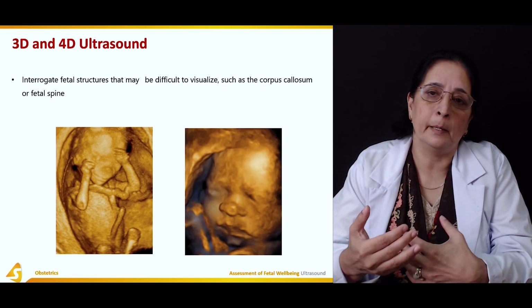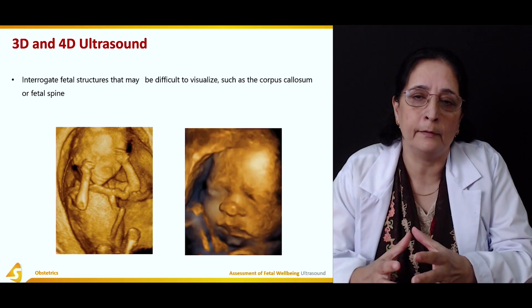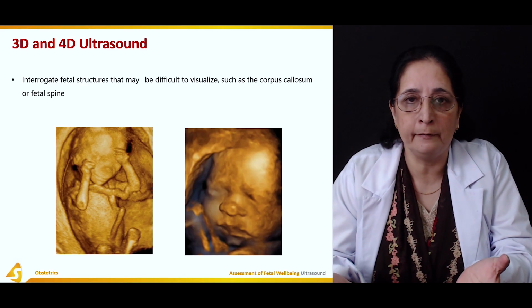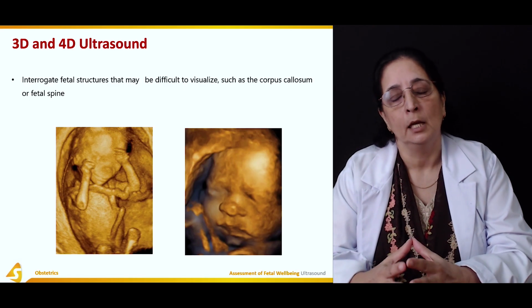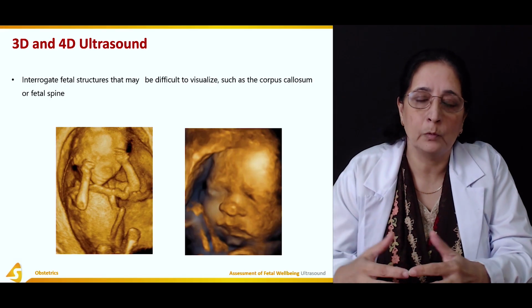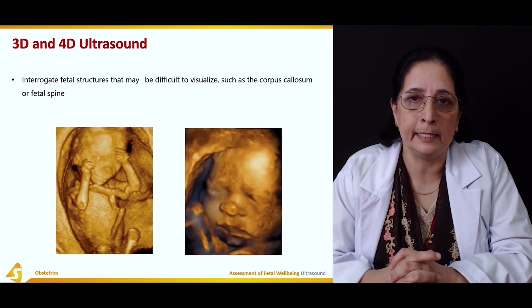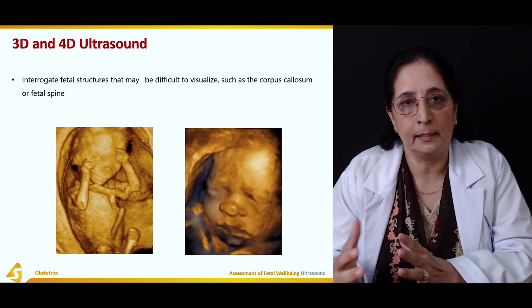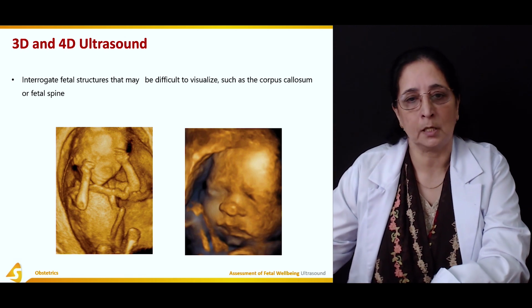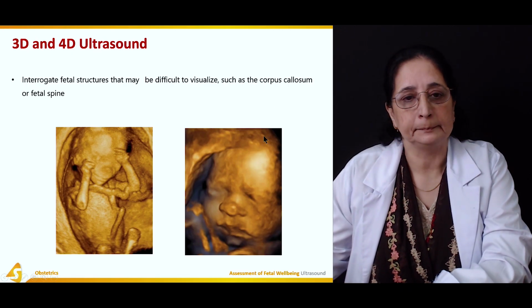So in females who have high-risk pregnancies, or a history of previous pregnancy loss, 3D or 4D ultrasound is usually indicated at least once in the pregnancy. So 3D and 4D ultrasounds are also available.